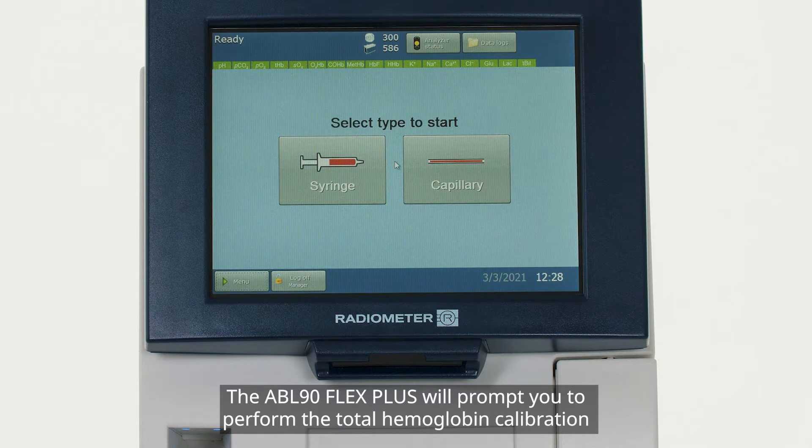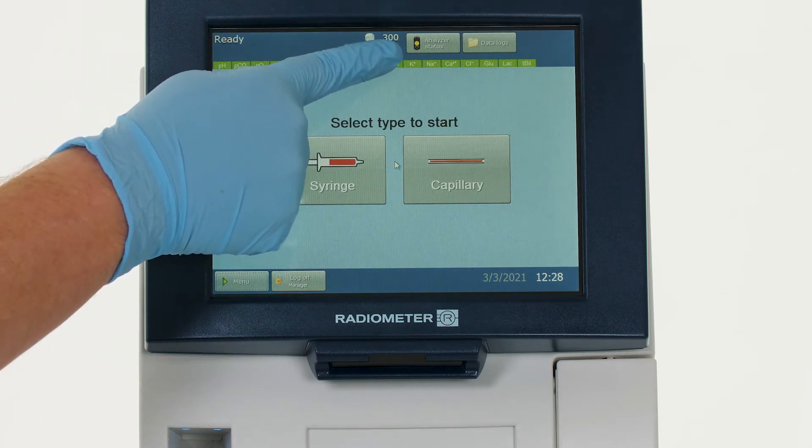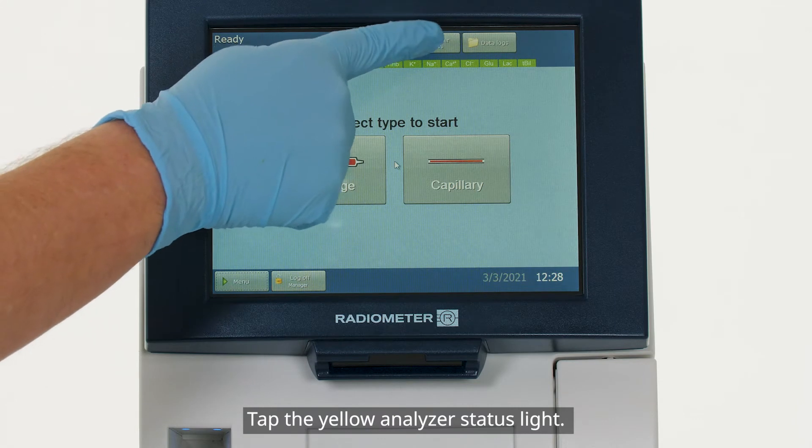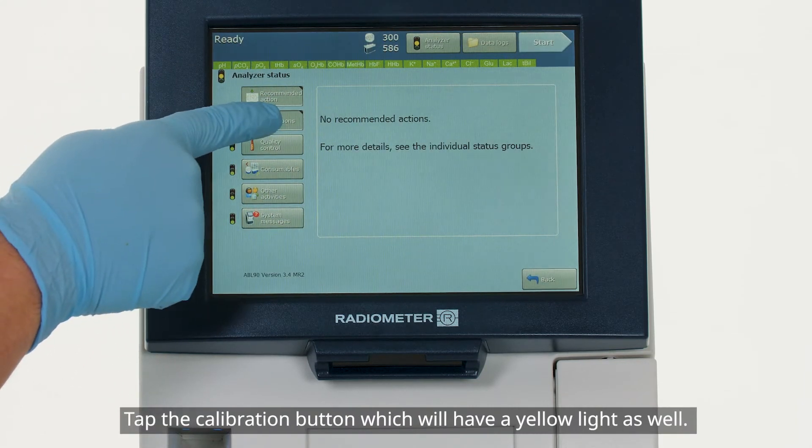The ABL90 Flex Plus will prompt you to perform the total hemoglobin calibration by turning the analyzer status light yellow. Tap the yellow analyzer status light, then tap the calibration button, which will have a yellow light as well.